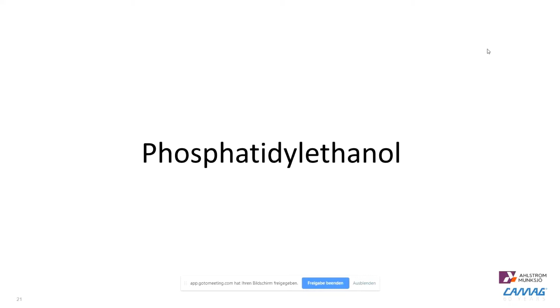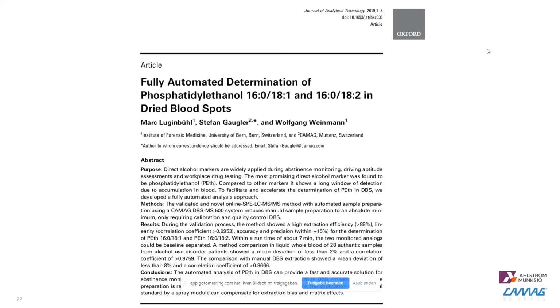With this, I go now to the second part. This is phosphatidylethanol. For phosphatidylethanol, we developed a fully automated method in dry blood spots, which we were able to publish in the Journal of Analytical Toxicology at the beginning of this year.